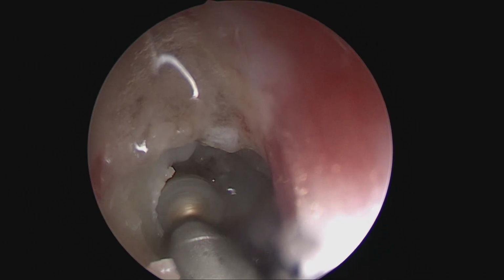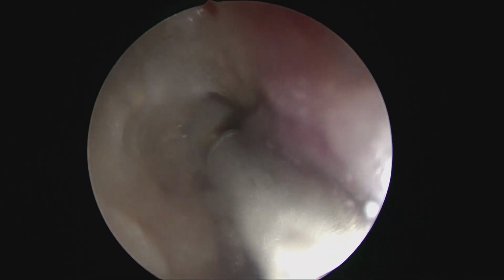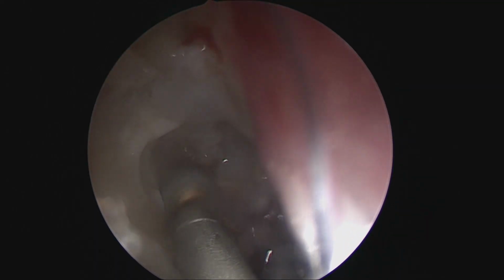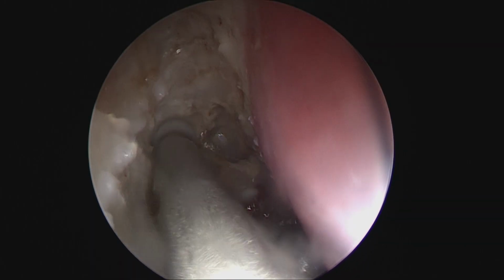Our dissection generally would be more anterior to it, and though we are not using any surgical navigation in this patient, it is an option that can be exercised, particularly for newer teams operating on these kinds of patients, because one could have loss of landmarks.